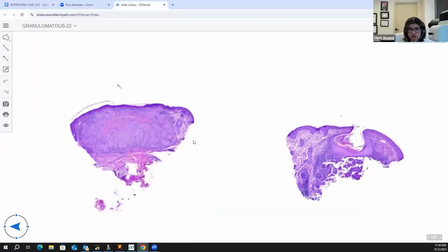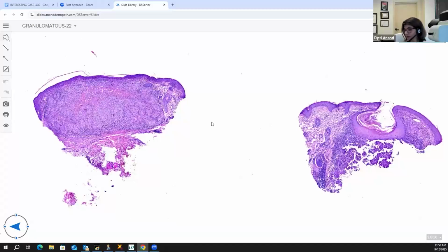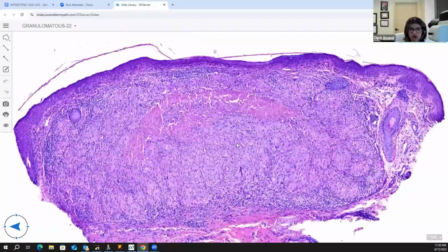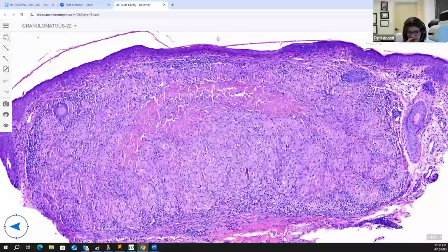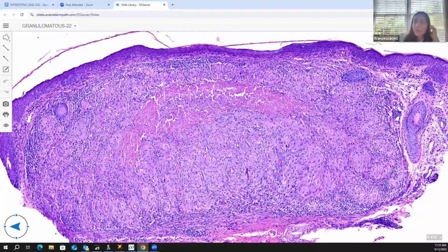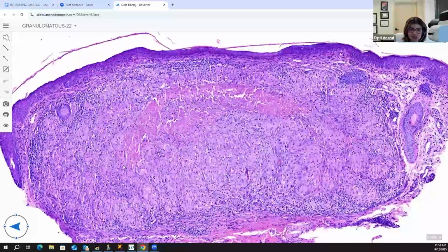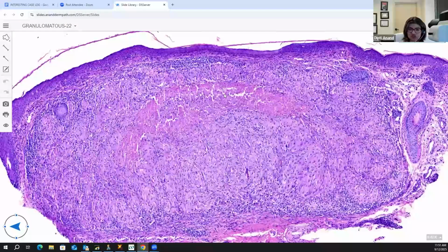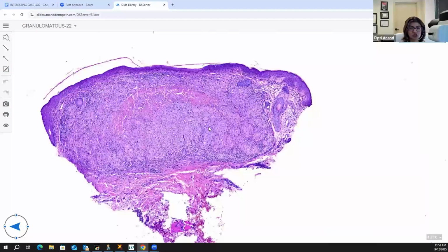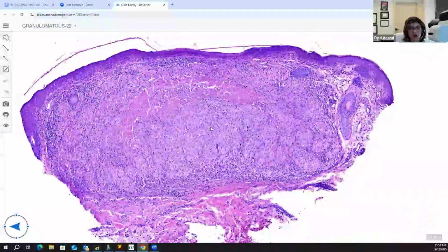This is the next one, 22. So a classic example. So we have this caseous necrosis surrounding the hair follicle, another slide. So lupus miliaris. Yes, so you see this one large giant palisaded granuloma with central caseation necrosis, and you can see it is in the path of a follicle. So this is beautiful for acne agminata or lupus miliaris disseminatus faciei. This is how it always looks.